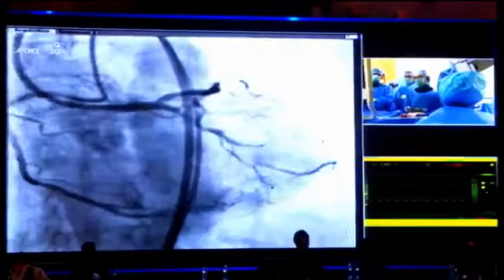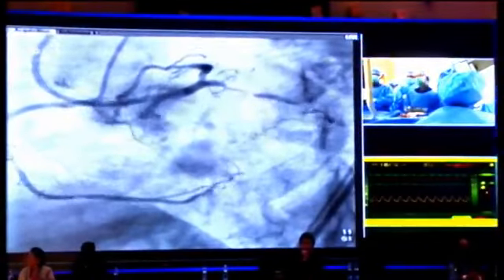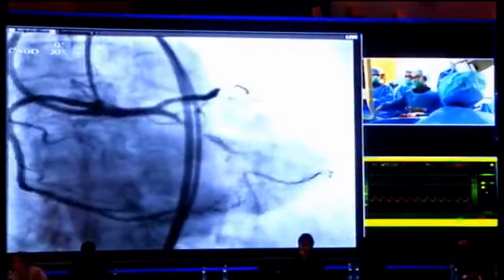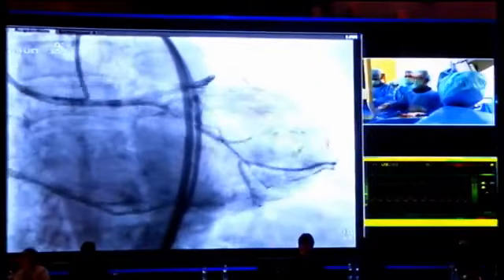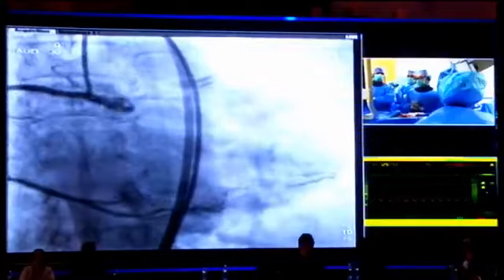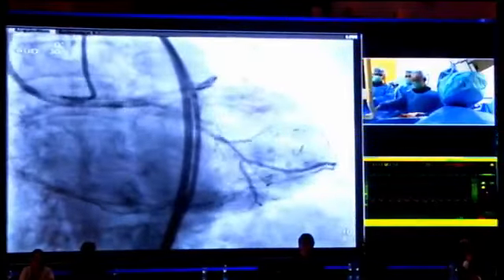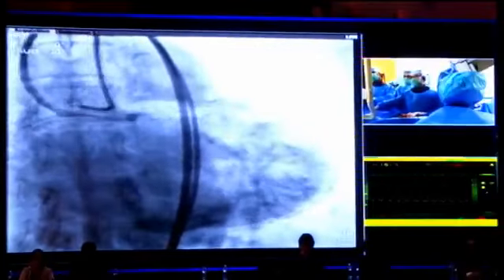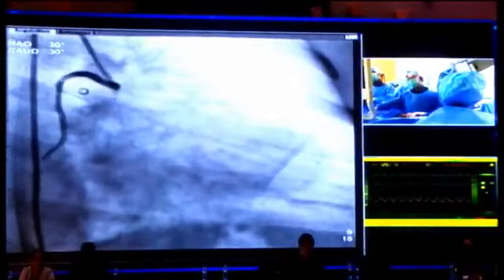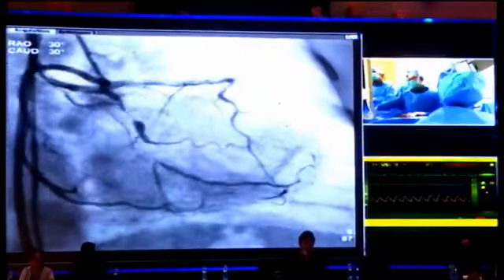So what we infer from you is that you're going to firstly use the antegrade approach. Yes, and from the J-CTO score we have the chance to pass through antegrade. You can go for the retrograde approach from the PDA branch as the last option. The segment is short, so I think you can first try the antegrade approach. But one inhibiting factor is that you have a side branch there, so maybe you need to use a double lumen catheter or something like that.